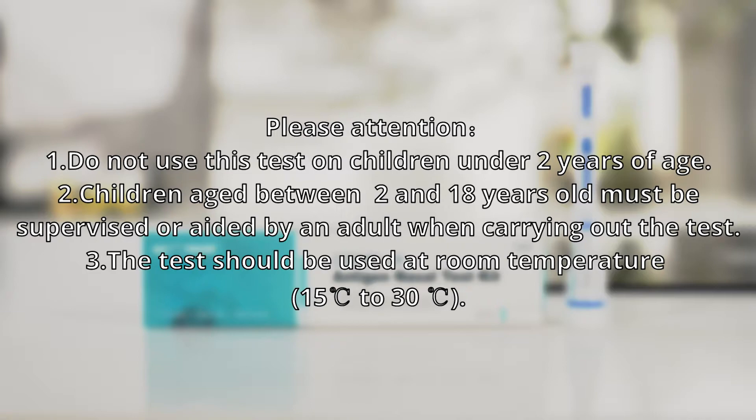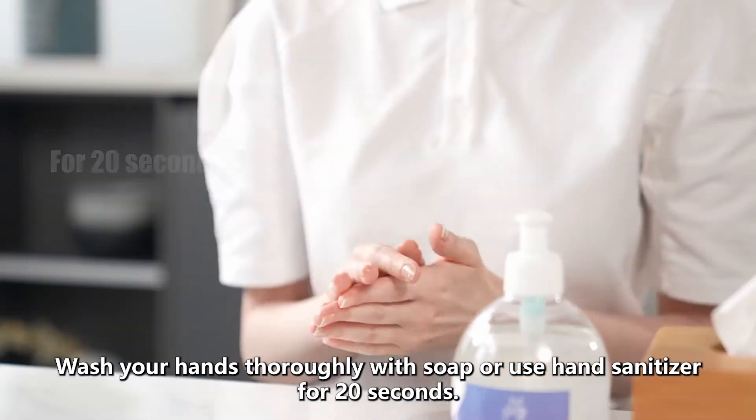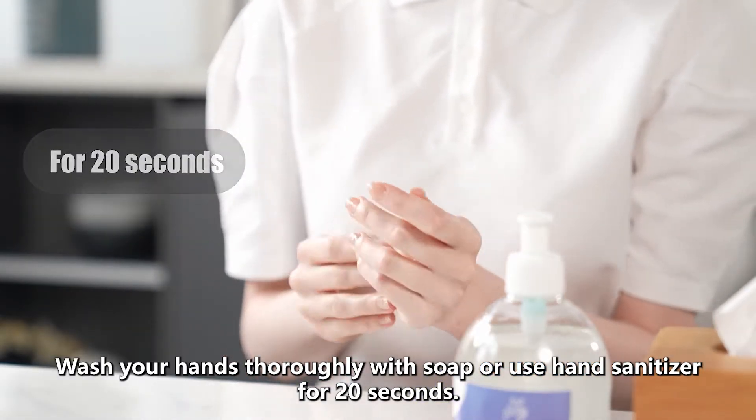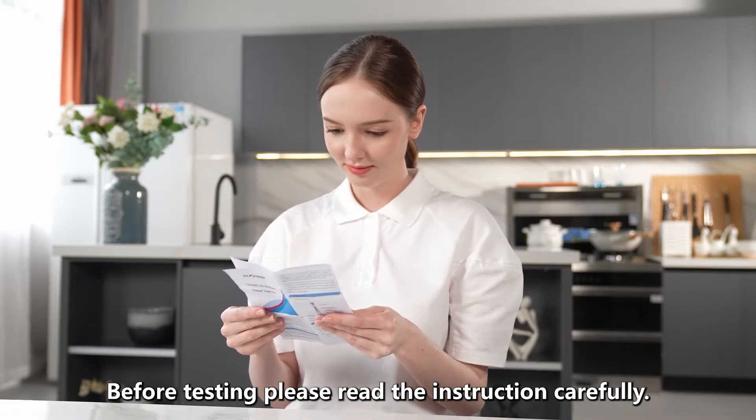3. The test should be used at room temperature, 15 degrees Celsius to 30 degrees Celsius. Wash your hands thoroughly with soap or use hand sanitizer for 20 seconds. Before testing, please read the instructions carefully.